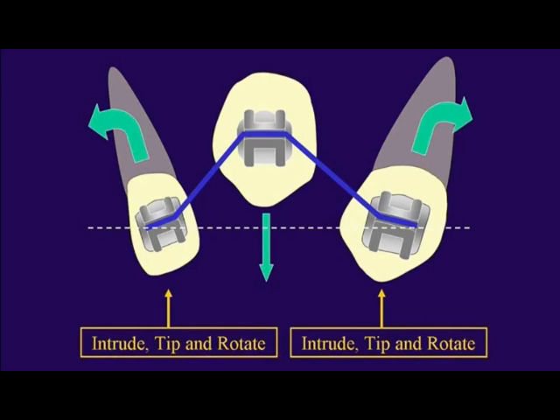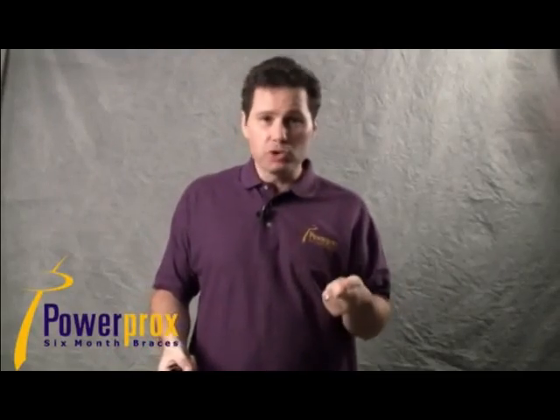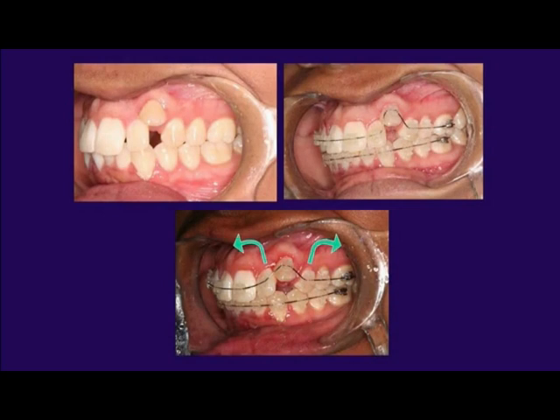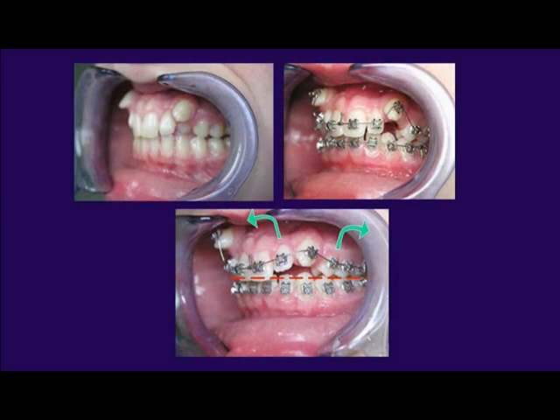Canine versus lateral and first premolar, canine usually wins, especially if there's crowding around that and there's not free space for that tooth to erupt into place. And that's exactly what happened in this situation. We have a doctor who went after his canine with continuous nickel titanium arch wire, and at the next visit, the lateral and first premolar had intruded, tipped, and rotated. Again, this can get really bad when you're going after these high canines inappropriately with continuous nickel titanium arch wire.